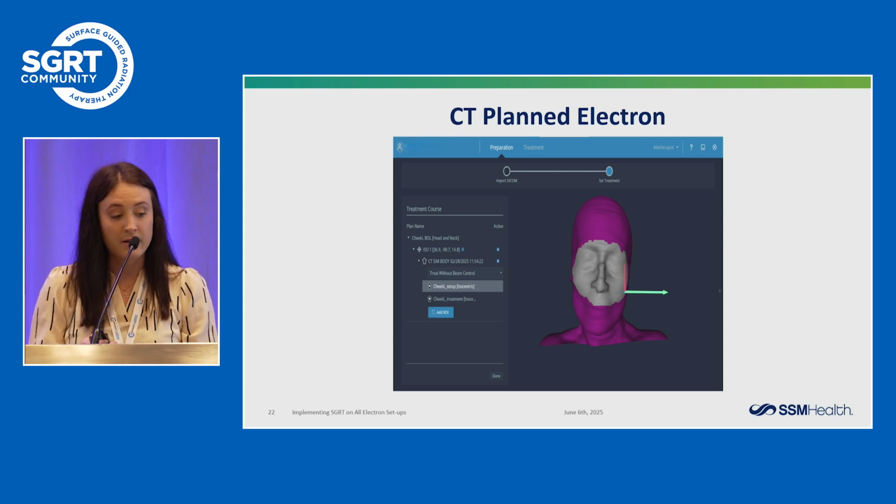And then I drew another one. I'm assuming that once we put that cone in, the left side of that patient's face is going to be blocked by that cone, so I just drew the ROI on the one side of the face.